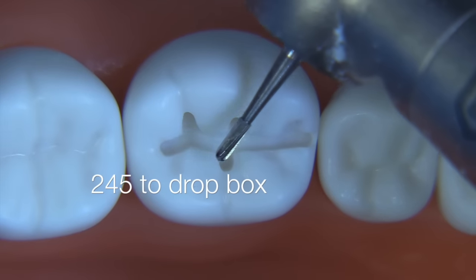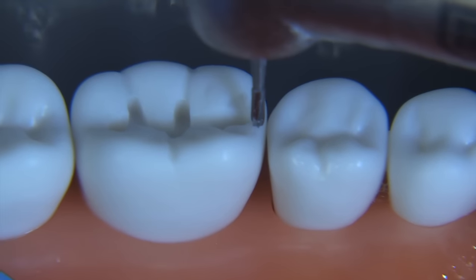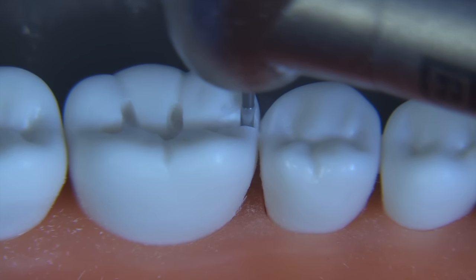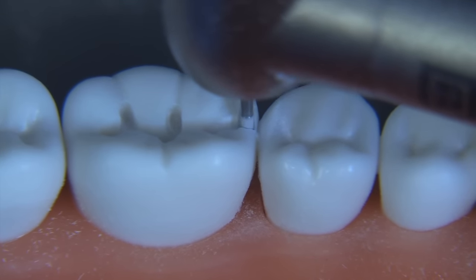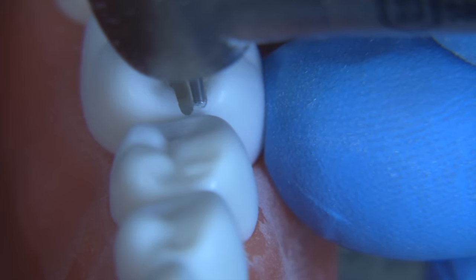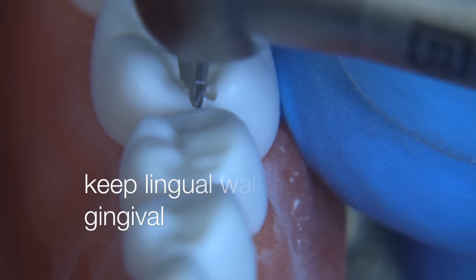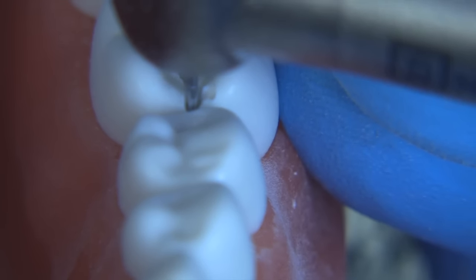Now it's time to move on to the box. Let's pick up the 245 bur and drop the box. The 245 bur has a round end, it's relatively straight — supposed to be slightly pear-shaped but barely so. We're going to move the entire bur to the depth of the flutes into the box area; you're almost always safe doing that. We're going to converge the facial wall of the box and make the lingual wall perpendicular to the gingival, so the opening of the box is convergent because of the buccal — not because of the lingual, because the lingual is in fact going to be perpendicular, following the morphology of the tooth.